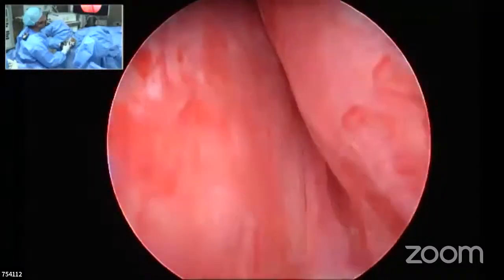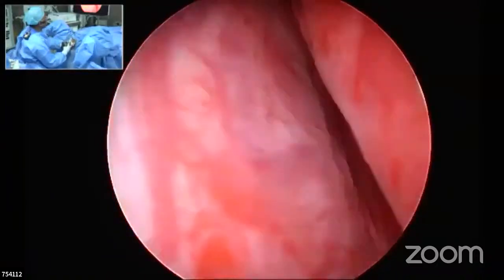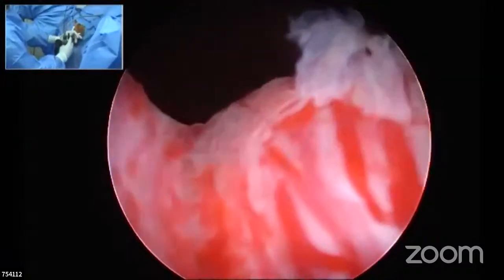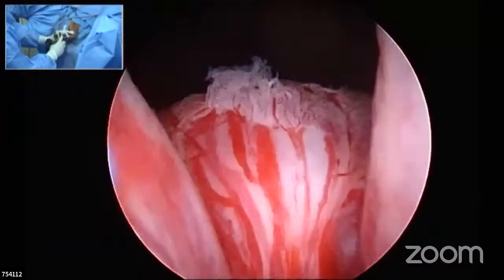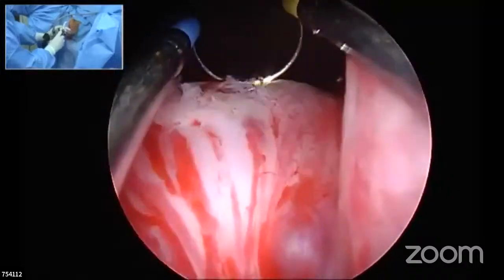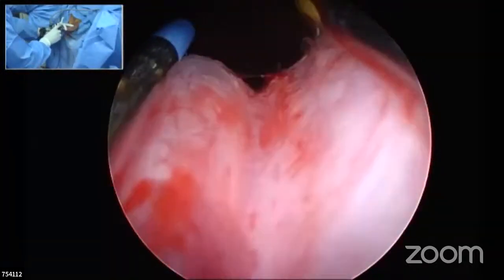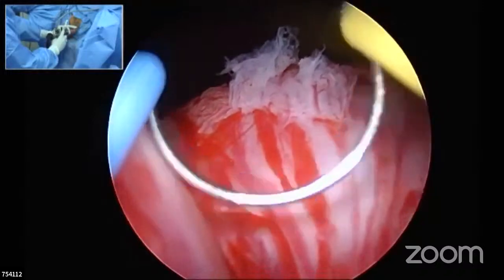So having done this, it's the anatomy of the prostate which determines what sort of a resection you do. Let us not talk about how to resect the lateral lobes, which will become of varied natures like a Nesbitt or a Burns technique. But resection of a median lobe is standardized. I don't think there is any difference of opinion regarding the resection of the median lobe. If there is a median lobe which is smaller like this, direct resection of the median lobe is good enough. But when there is a median lobe which is very large and moves into the bladder, it is always better to resect on either side of the median lobe, identify the vessel, and then fulgurate the vessel, and then resect the median lobe, which becomes avascular.